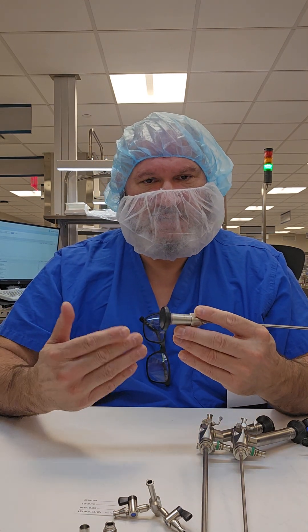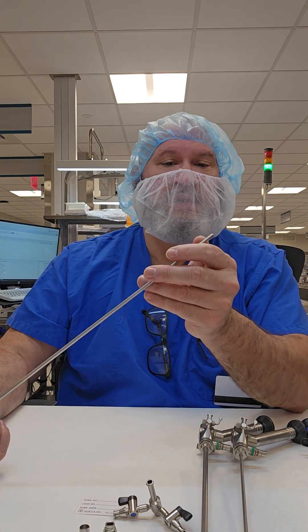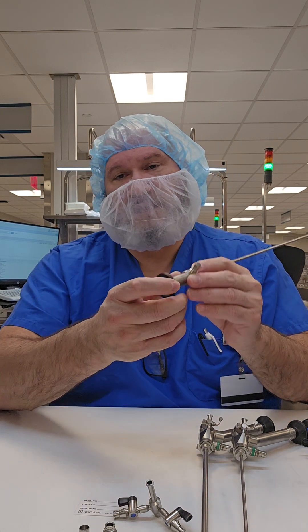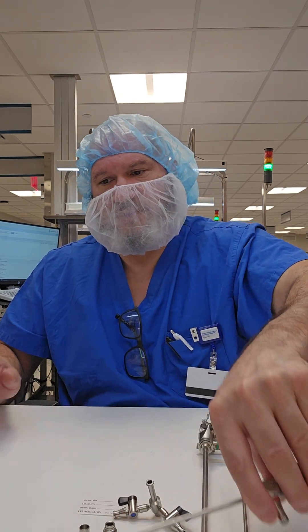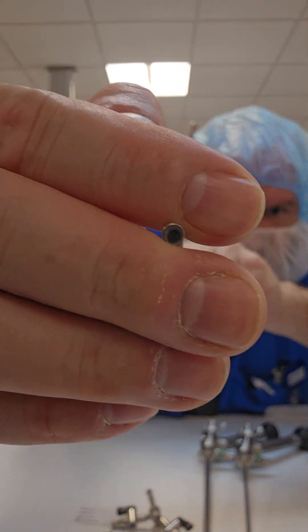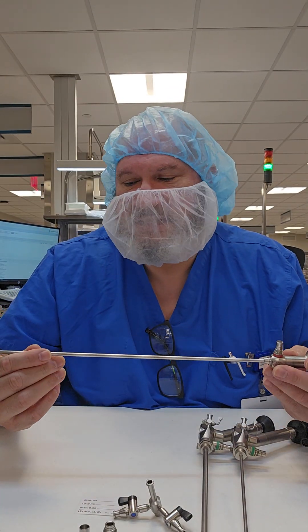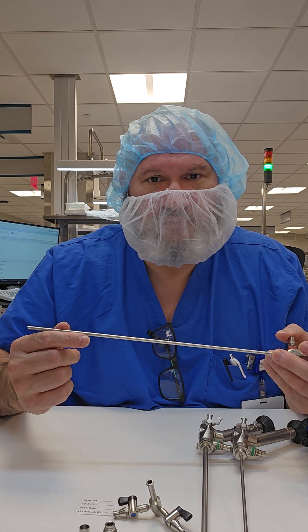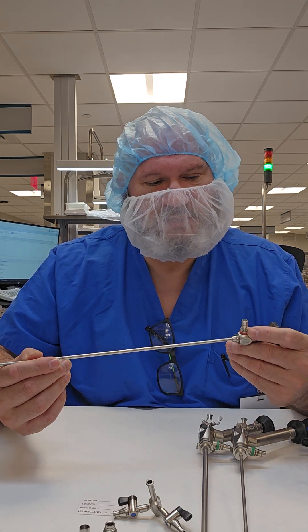On the prepping pad side, we want to inspect for cleanliness. We want to ensure that the glass at the distal tip is not cracked, as well as the eyepiece. When you're visually inspecting — just like this one — there's a little glaze over the eye, which indicates improper rinsing and decontamination, leftover dry detergent, or wear and tear of the scope itself.